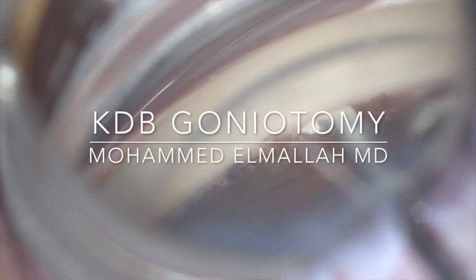Hi, this is Mohamed Elmala from Ocala, Florida. This is a short video showing a Cahook dual blade goniotomy done under direct gonioscopic visualization.